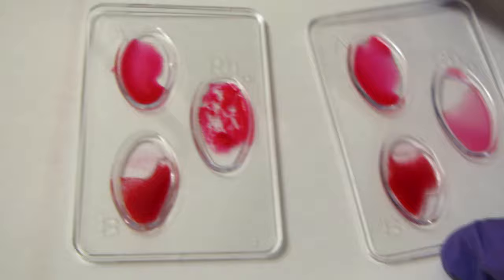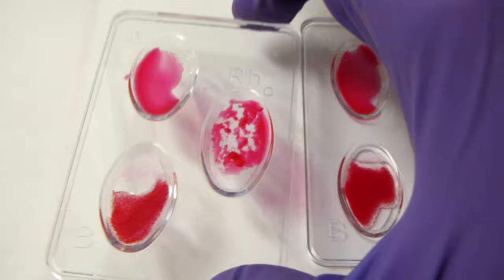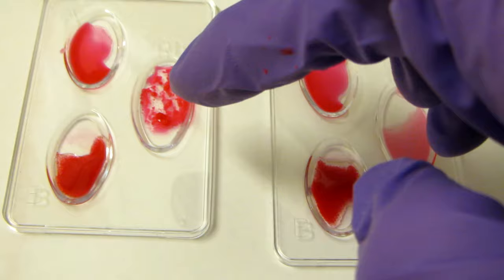Here we've got our type B bloods — you can tell there's no clumping in the A and there's a lot of clumping in the B. So we have B positive and B negative here.